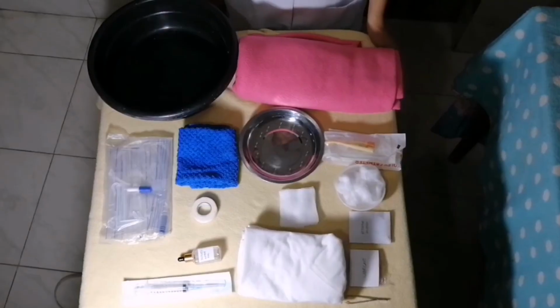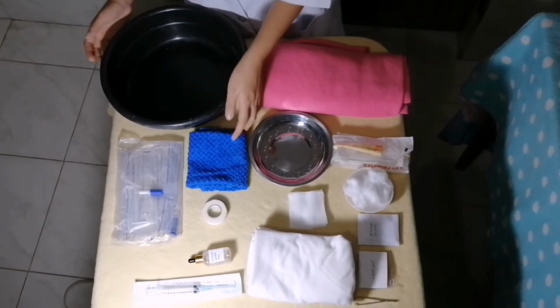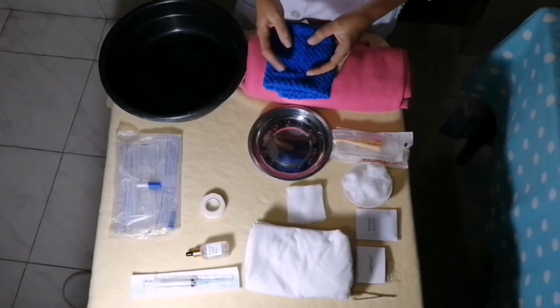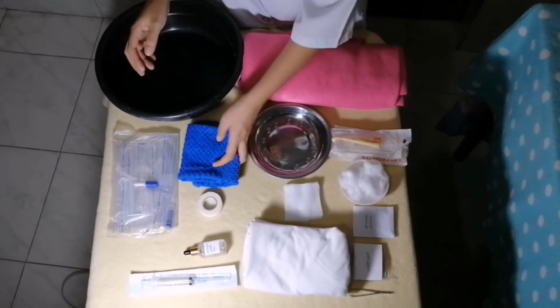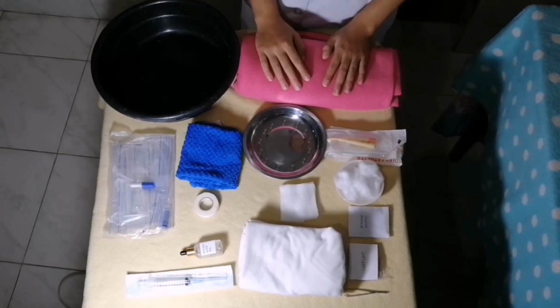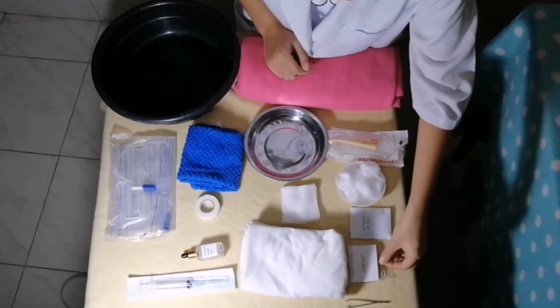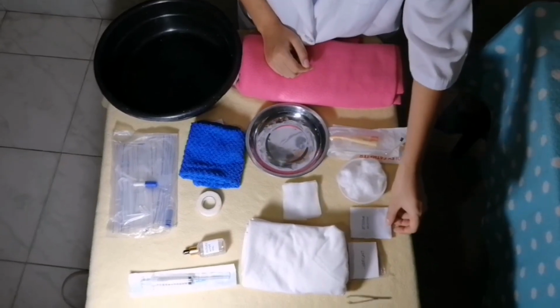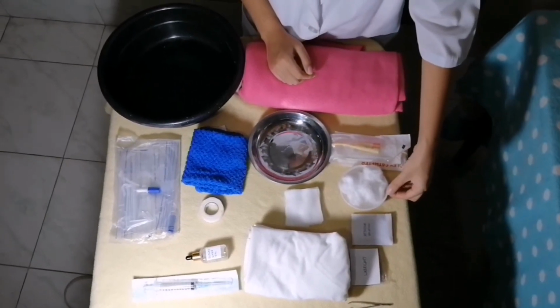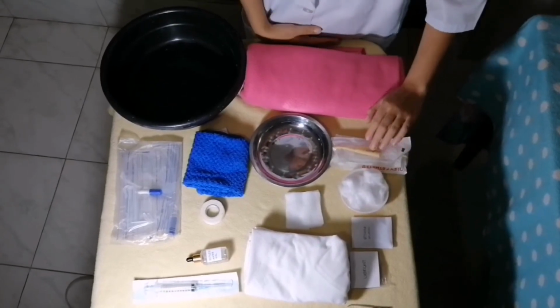So here are the materials needed. So we have here the bedpan, and assuming that this is a waterproof underpad, the bath blanket, and the tray that contains the following. So we have here the forceps, the lubricant, the betadine solution, the sterile dried cotton balls, the catheter, the drape.